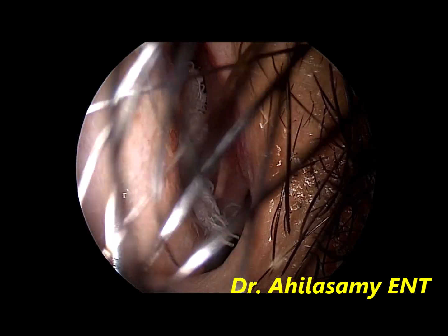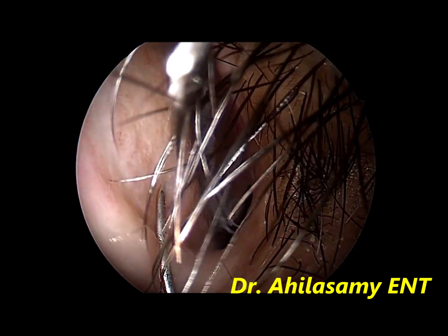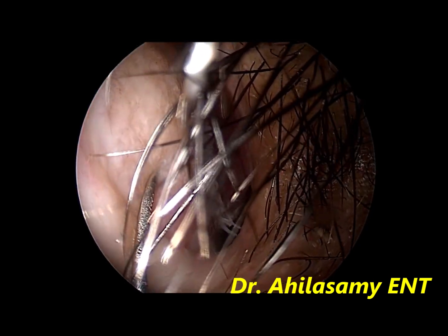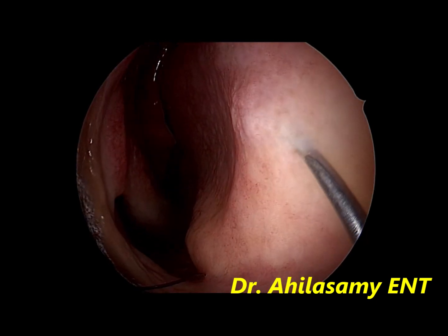Since I am going to do a subtle correction in this case, I am infiltrating the septum for hydro-elevation and for some anesthetic effect also. Now it is being repeated on the right side.